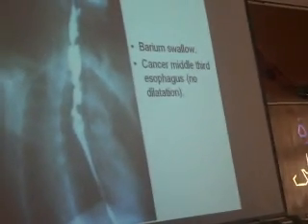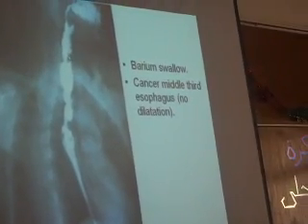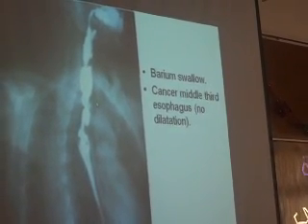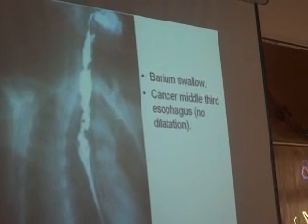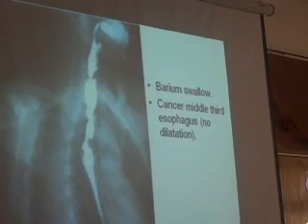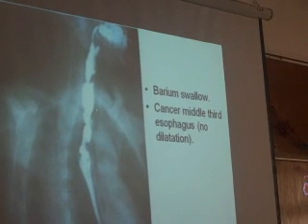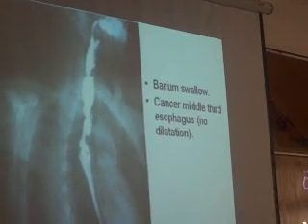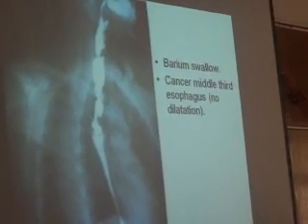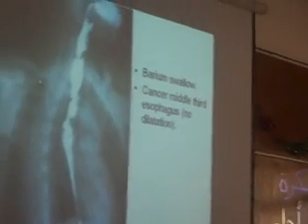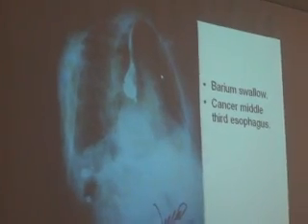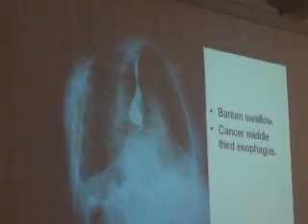Another X-ray barium swallow from the upper end of the esophagus to the middle third — cancer of the middle third with irregular stricture and multiple shouldering or multiple irregularity at both sides. The lower third is normal esophagus. This shoulder and another shoulder — the irregularity over a relatively long segment means it is not achalasia or spasm; it is cancer esophagus. Other investigations needed: upper GI endoscopy and biopsy.